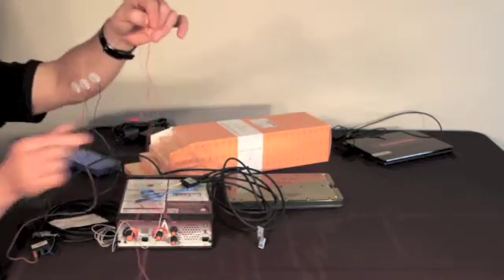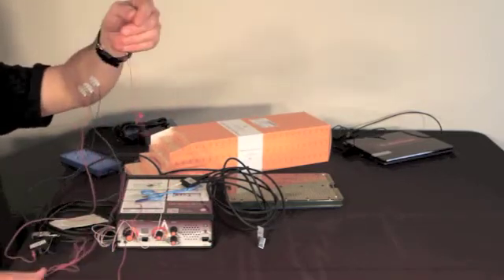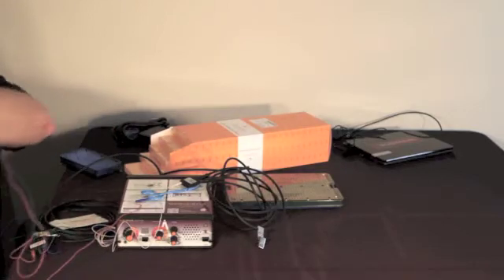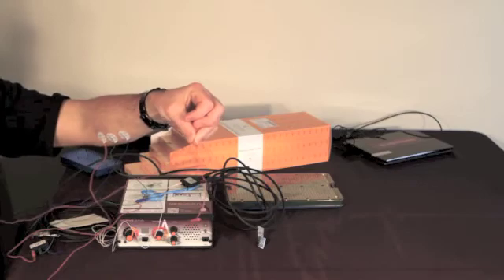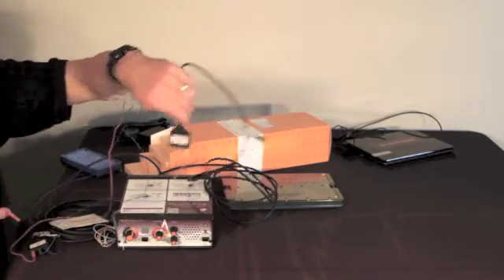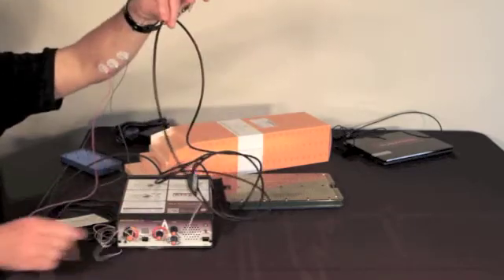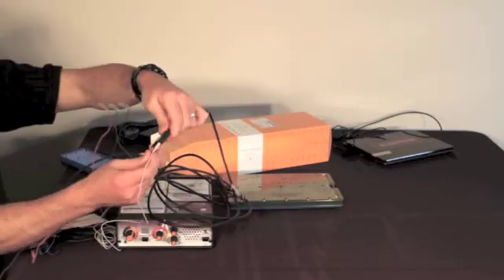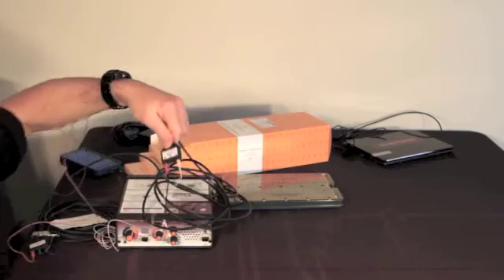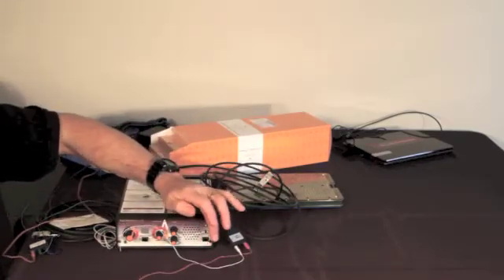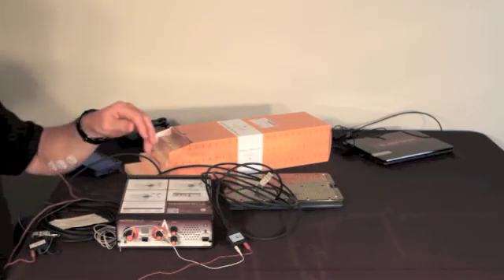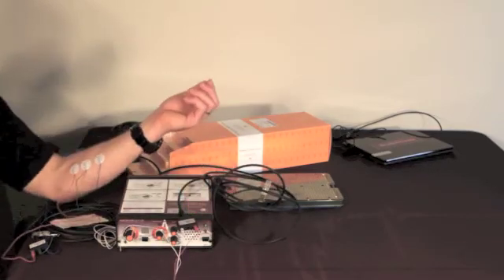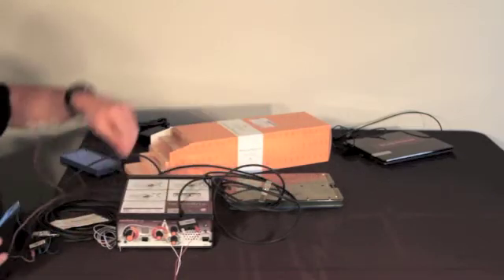This red tip is the end that's passed out off of the sterile field. This is typically hung out for either the circulator nurse or the Nirvana factory rep to plug in to this stimulator port. This should be hanging down lower away from the patient. You can come up under the drapes and what you want to do is just get a nice snap sound and you know that that has seated into the plug. Finally, verification of the connection is possible by touching the patient and testing that stimulation is being delivered.